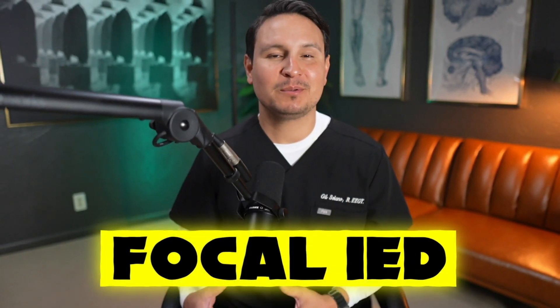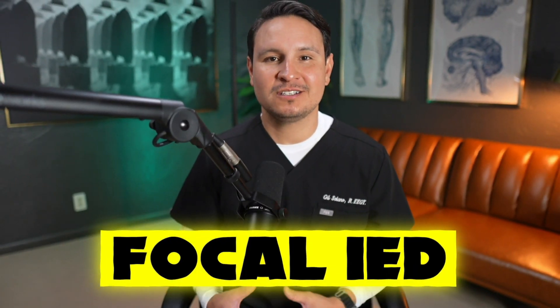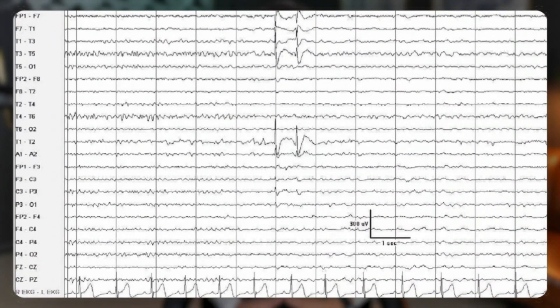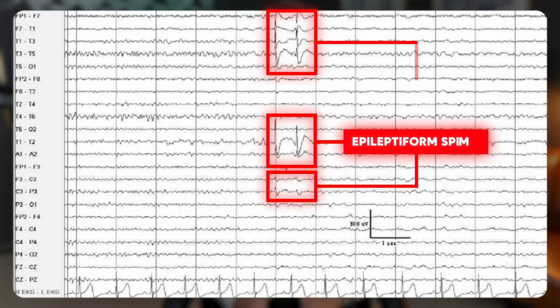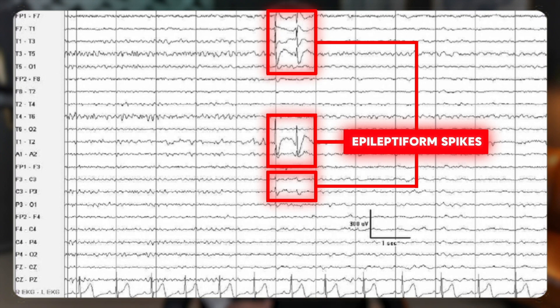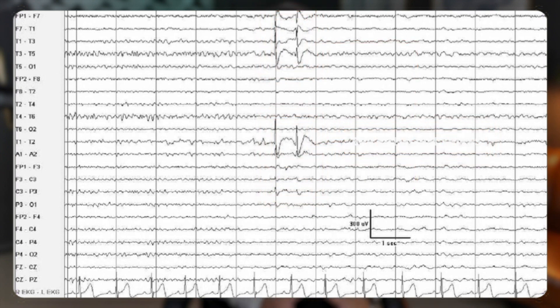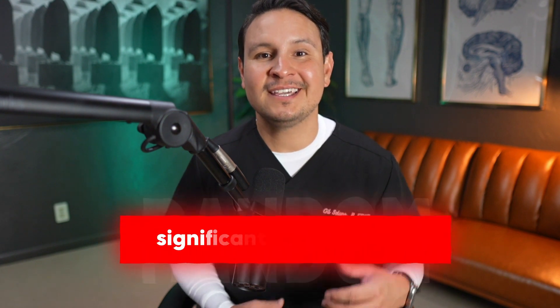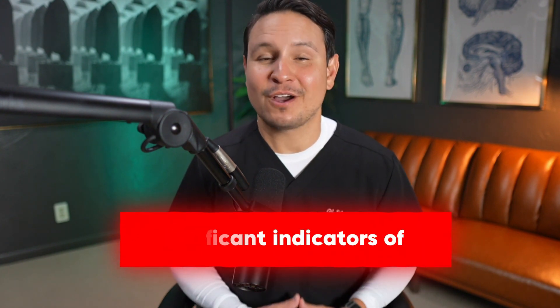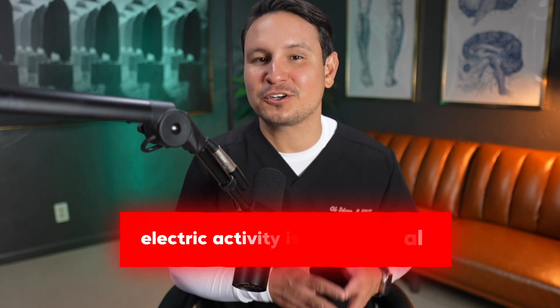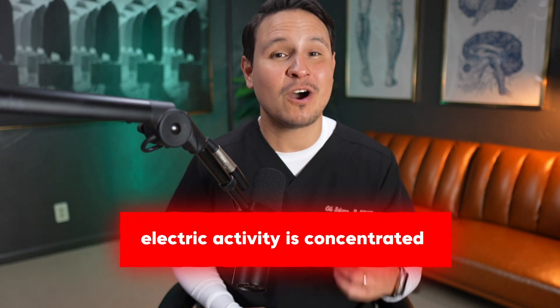Focal interictal epileptiform discharges are specific to a localized area of the brain and include epileptiform spikes, which suggest a focal mechanism is at play in a patient with a clinical diagnosis of epilepsy or seizures. These spikes are not just random events — they are significant indicators of where the brain's abnormal electrical activity is concentrated.